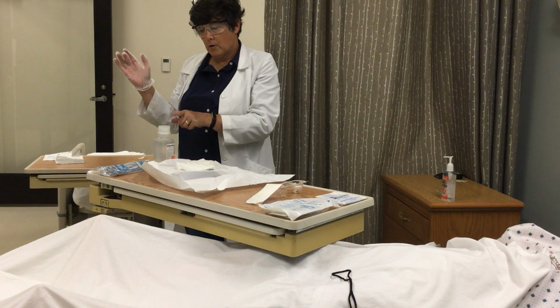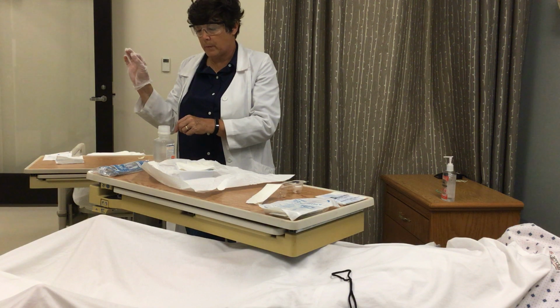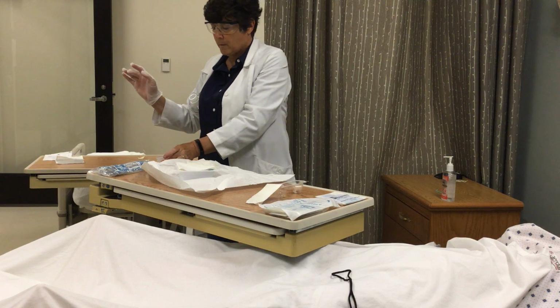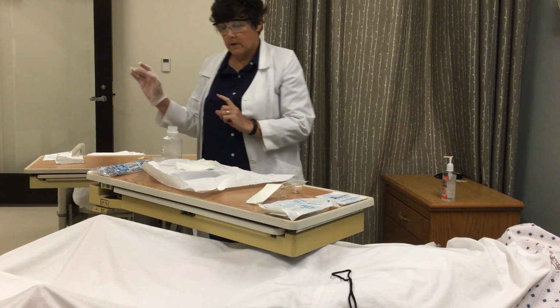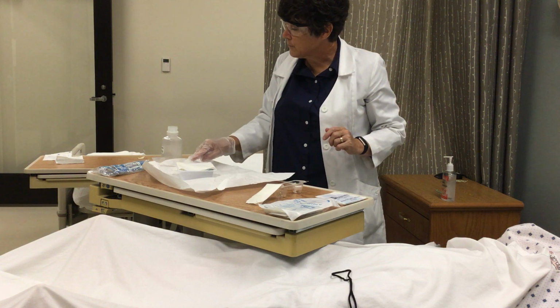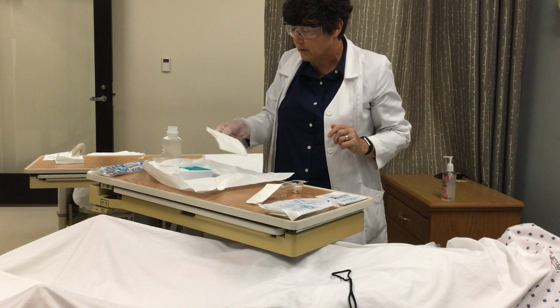Now, normally you could open this cap ahead of time. If you find yourself in a little bit of a pickle and you've got one sterile hand, you can tuck it under your arm, open up the bottle, and have your bottle prepared, if not prepared ahead of time. Now that I have a sterile hand, I'm going to parcel out all the objects onto my sterile field, just like you do with any sterile field.